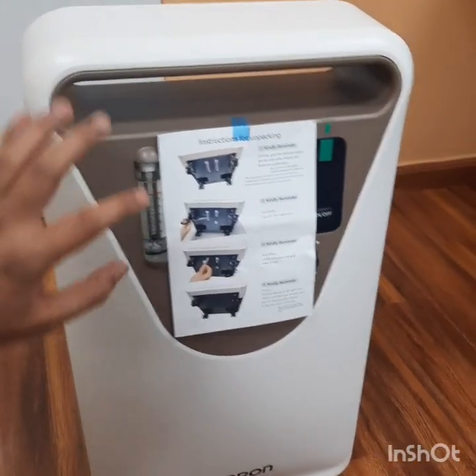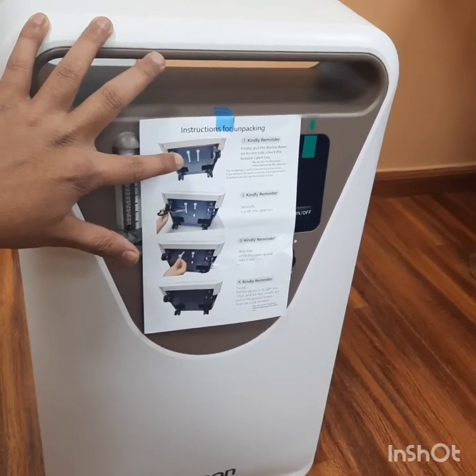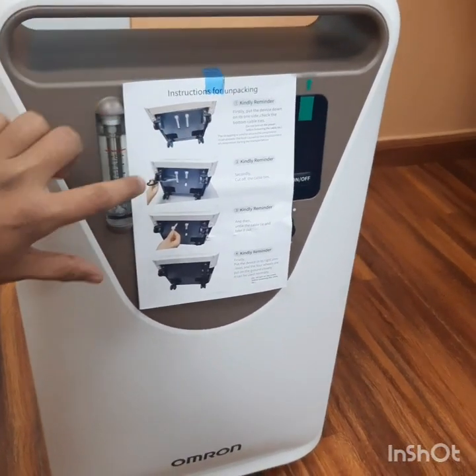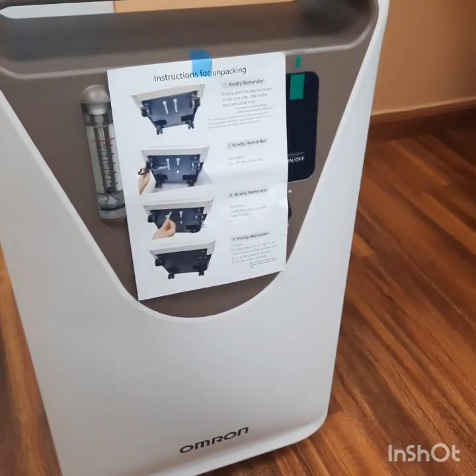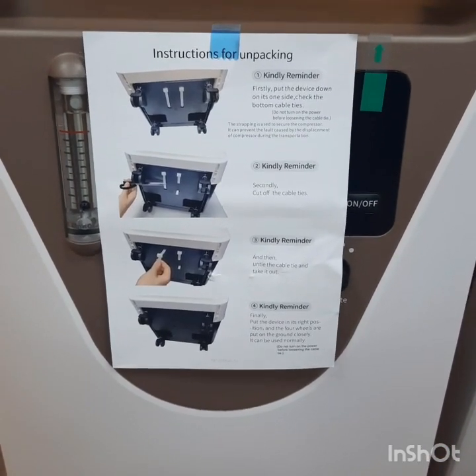Once the unit reaches the customer's side, we need to cut the tie bands on the bottom where the wheels are located. These two tie bands must be cut out before operation of the machine. Take out this tie band.